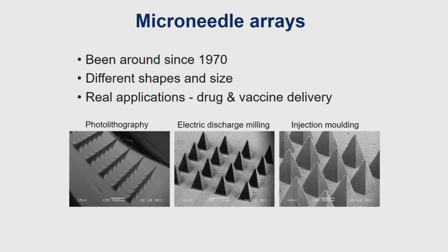Because they're in solid state, you don't need any cold chain there, right? So that's why these microneedles are also very popular for therapeutic drug delivery applications as well. And you can actually combine them. You saw the talk on artificial pancreas, wherein you were talking about insulin pumps for delivery and microneedle array and your sensors for diagnostics. You can combine therapeutic drug delivery and diagnostics and make it into a theranostic device, wherein the thera comes from the therapeutic drug delivery and the gnostics comes from the diagnostics.